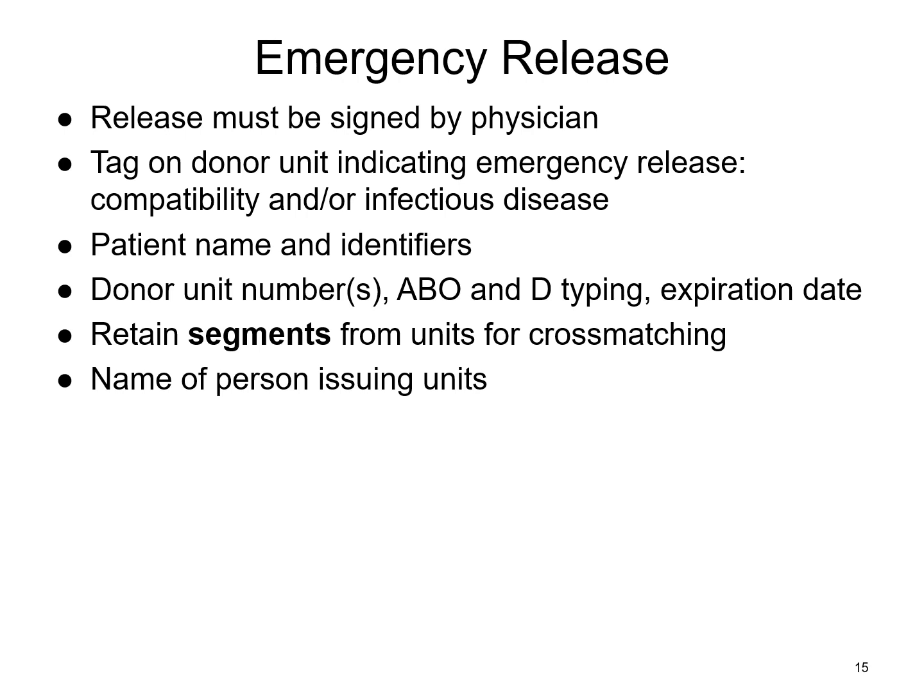Now, if you've got a patient that comes in as a John Doe or a Jane Doe, and they don't have any identification on that patient, you're just going to have to run it like that. So that patient may stay as that John Doe or Jane Doe in your system, just to indicate that they have no identification, until they're able to resolve that.